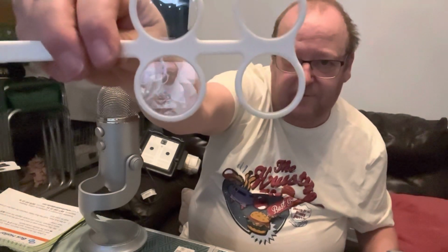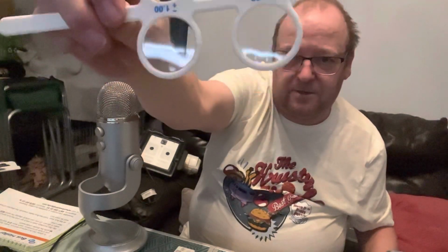And the last paddle is the plus and minus 1. So again, the plus paddle to magnify, switch it across, and now you've got the minus paddle to minify. Each paddle is only one prescription different, but it's amazing how much difference that can actually make.